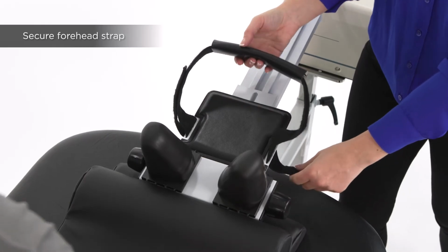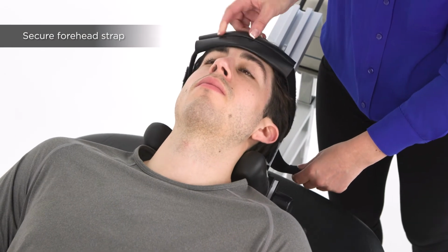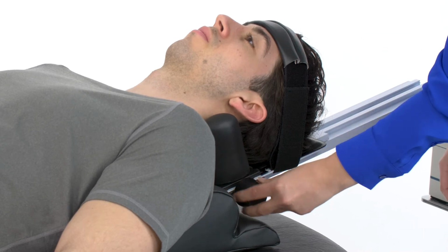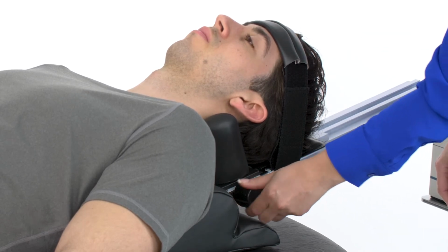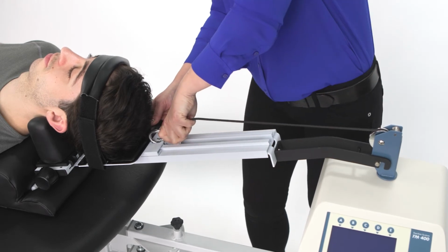With the patient supine and comfortably positioned, slide the forehead strap into place and adjust its tightness for a comfortable fit. Tighten the wedges until they rest snugly against the patient's neck. Connect the traction motor pull cord to the Saunders clinical traction device.